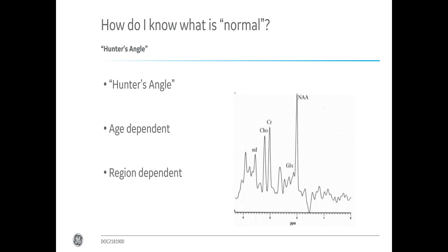And he's true, or at least in most clinical applications where we can diagnose based on the pattern we are seeing, just by looking at a spectrum and not really quantifying it and looking at numbers, there's really a way to say this is a normal spectrum, or this is how a spectrum should look like, and therefore if I see other patterns, I can already give a diagnosis without using fancy quantification techniques that give you at the end numbers of concentration of metabolites.